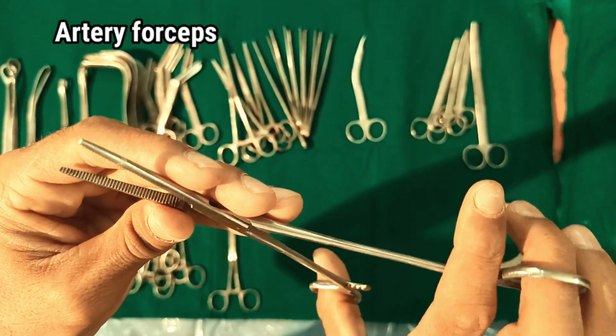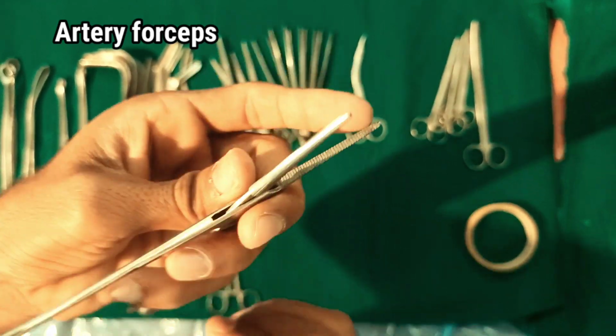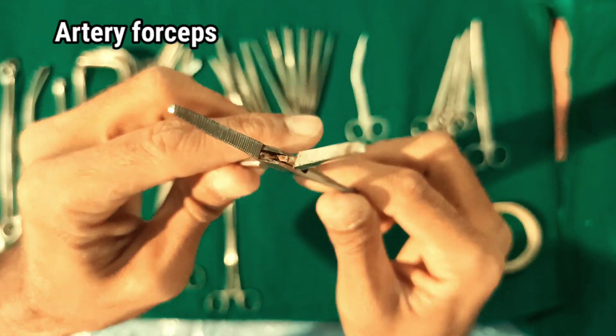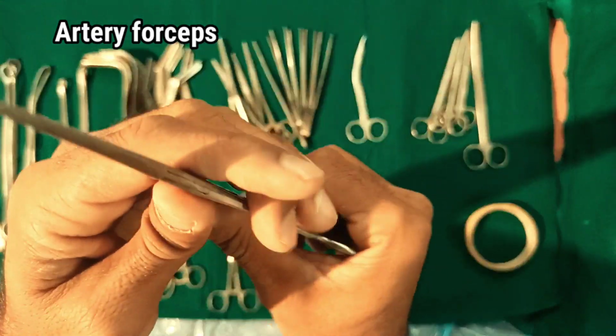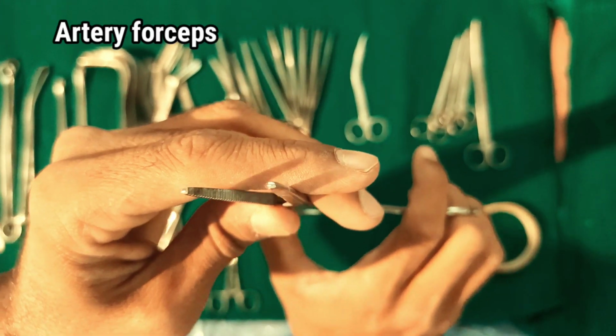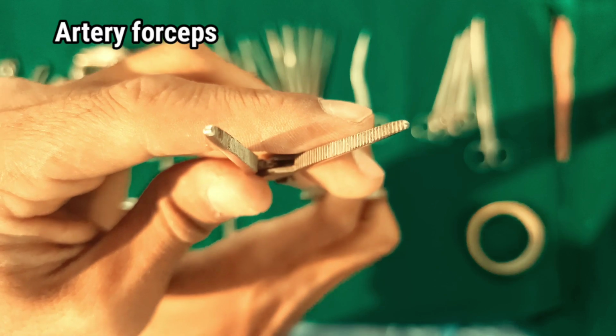Artery forceps. Artery forceps are an instrument used to control bleeding from blood vessels by clamping the artery, a process known as hemostasis. They feature a locking mechanism at the top of the forceps to secure them in place during the procedure.